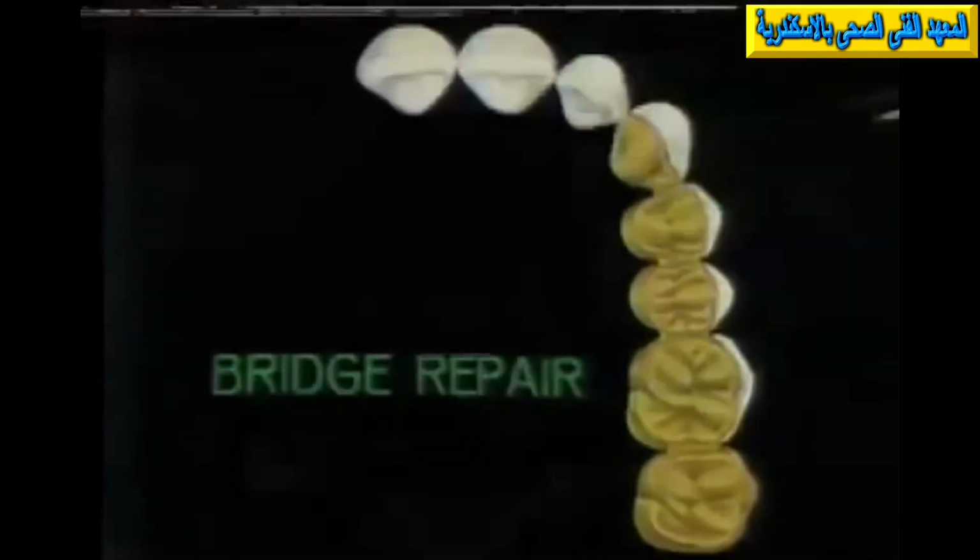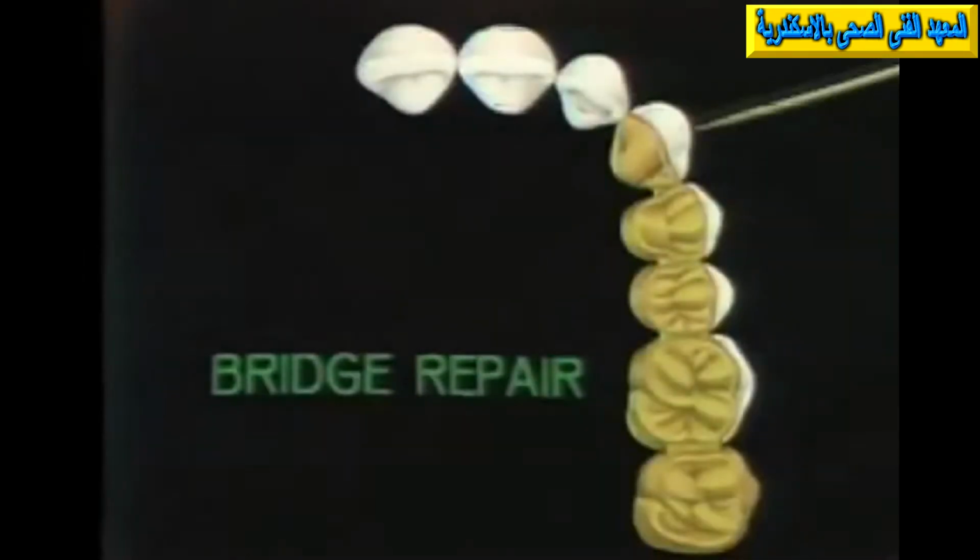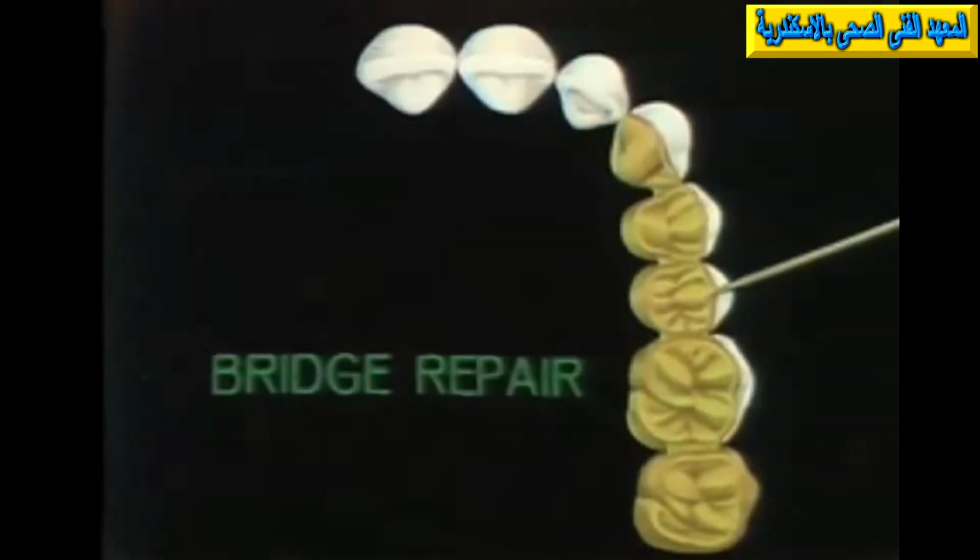This diagram shows a case in which the semi-rigid connector can be used in repairing a bridge. This is a 5-unit maxillary bridge with a pin ledge on the cuspid, a pontic here, a 3/4 crown on the bicuspid here, a molar pontic there, and a complete crown on the second molar here.